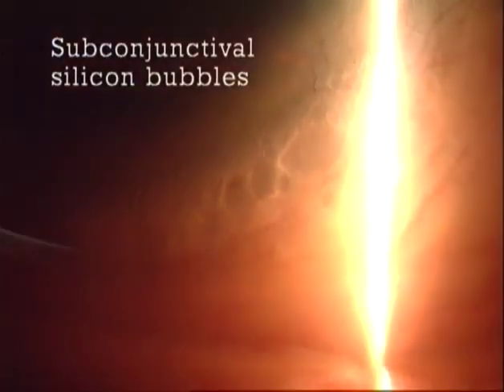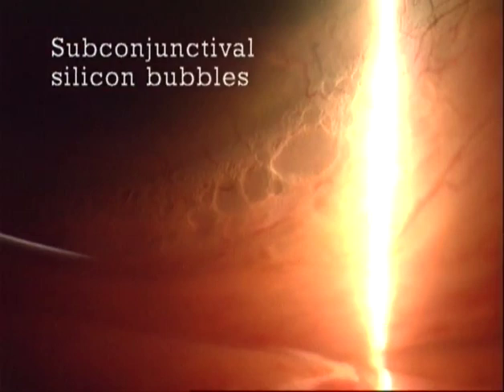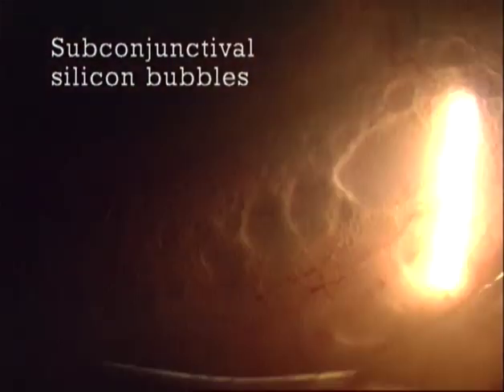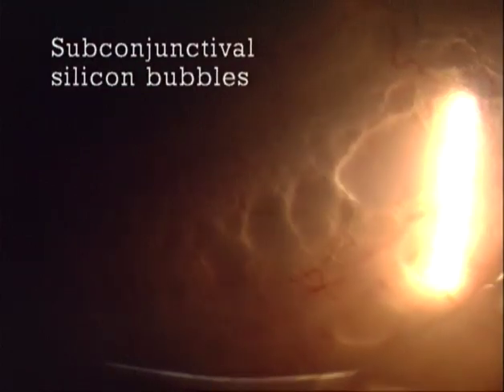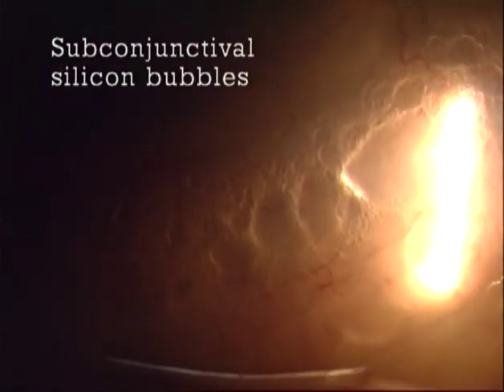Another exceptional example is this case of retinal surgery, where silicone oil was used. Residual silicone oil bubbles in the conjunctiva are made visible with indirect lateral illumination. Here, the margins of the bubbles are illuminated on the side opposite the incident light, due to their higher index of refraction.